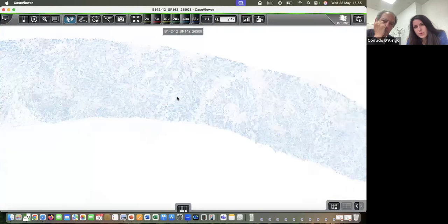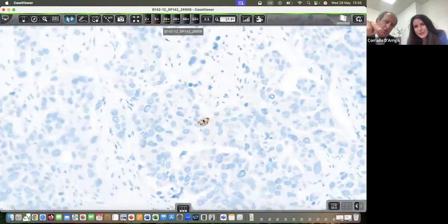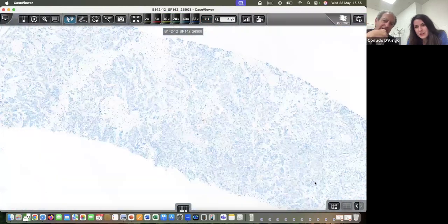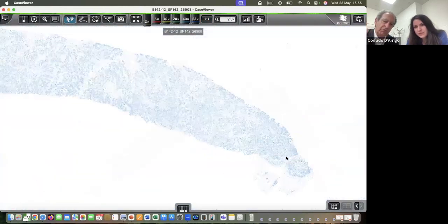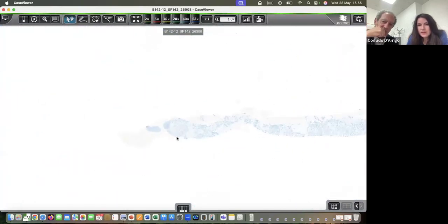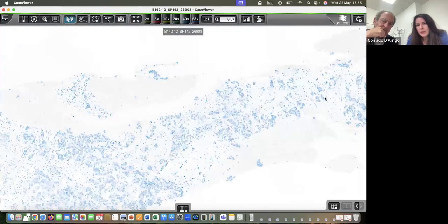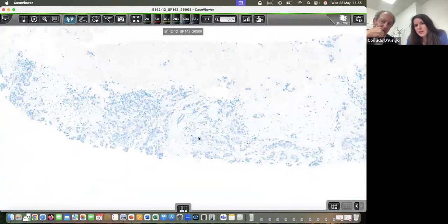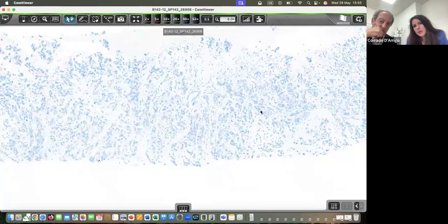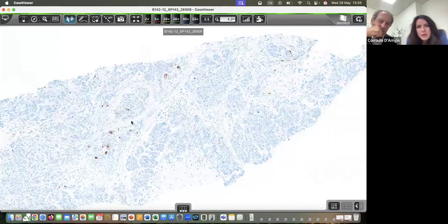I think I did report the one, but I think it wasn't breast, to be fair, with tumor cell staining. You see how much heterogeneity there is in the tissue. Yeah, and that's not an uncommon finding. And this takes us to your point of, if negative, trying to repeat. If negative, and you have more tissue, do it on additional blocks.